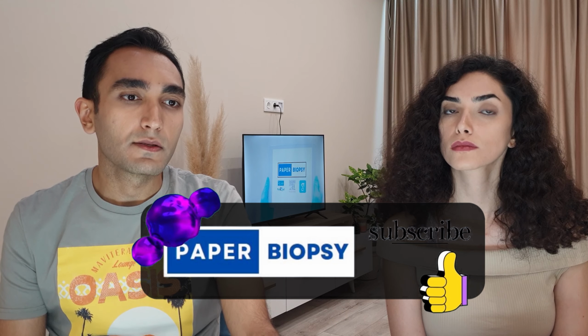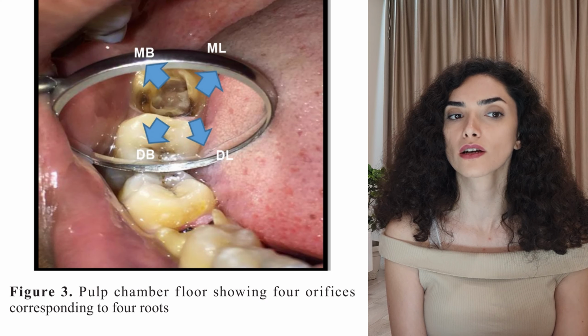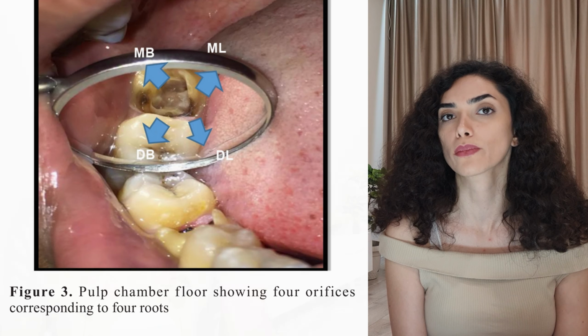They began by administering local anesthesia and preparing the access cavity in a conventional triangular outline form. They were able to locate 3 orifices corresponding to the mesiobuccal, mesiolingual, and distobuccal roots. They discovered a unique pattern of developmental root fusion lines forming an X configuration on the pulpal chamber floor. They carefully extended the access cavity to expose the distolingual root canal orifice using ultrasonic tips.